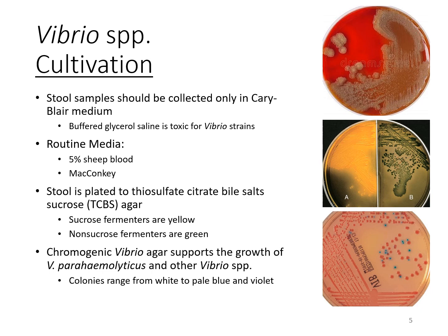You may have the O&P, the ova and parasite collection containers, as well as your culture and sensitivity collection containers, and those have a little bit of liquid inside of them. That liquid media is actually there to help preserve the organisms in that stool sample, as well as to keep anything from overpopulating the other organisms.